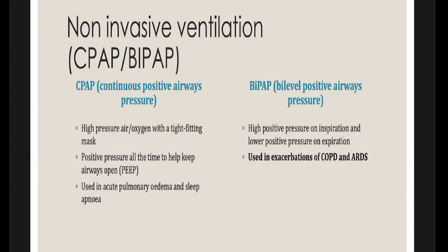In susceptible patients who are very weak and cannot cope with this stress, they are more prone to have collapsed alveoli and respiratory bronchioles during expiration. Because of that, we need to maintain a positive end expiratory pressure to keep the alveoli open.